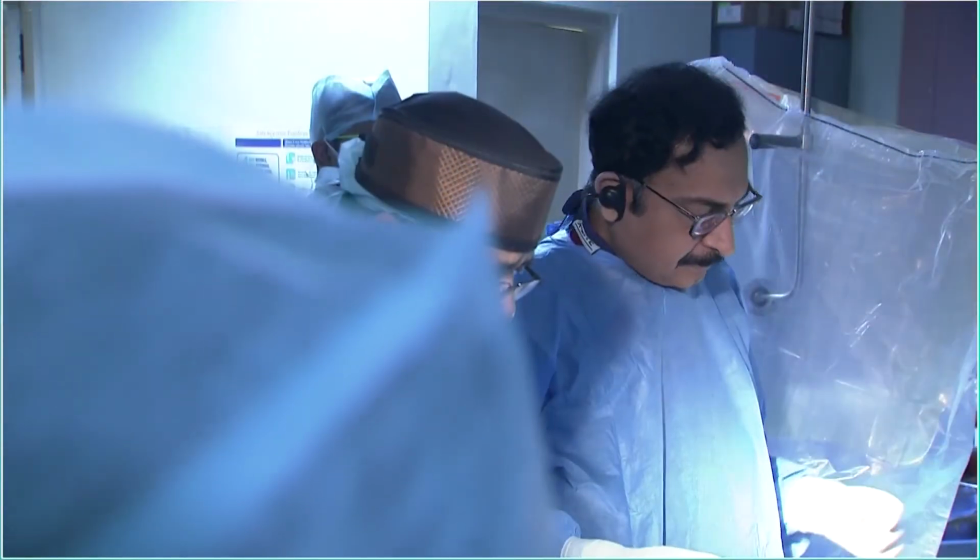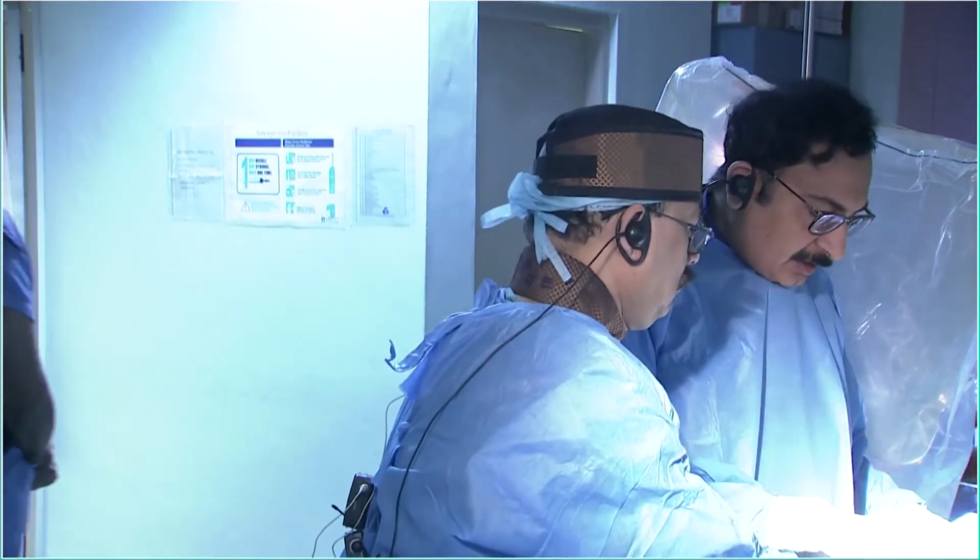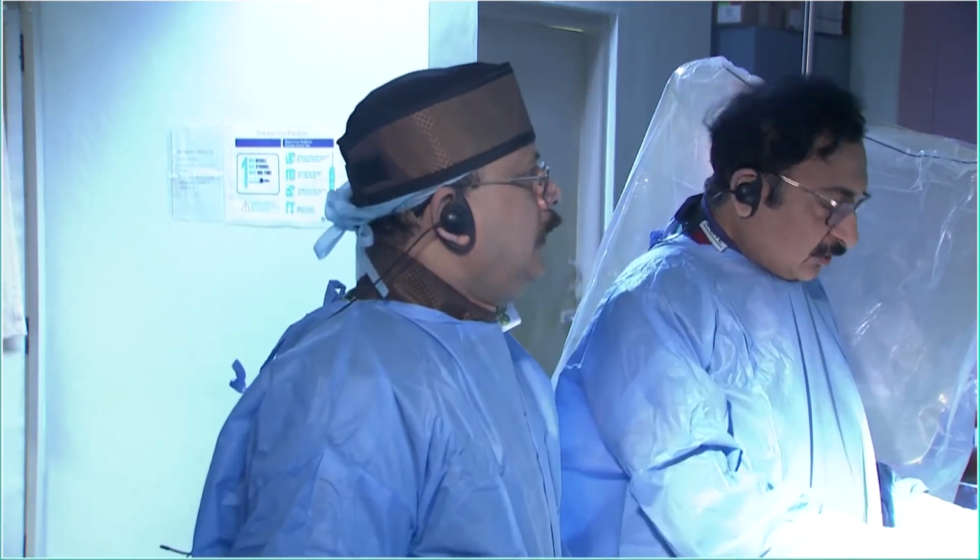Okay. Dr. Khanna, we are with you. Yes. What is the progress? Show me the last view.